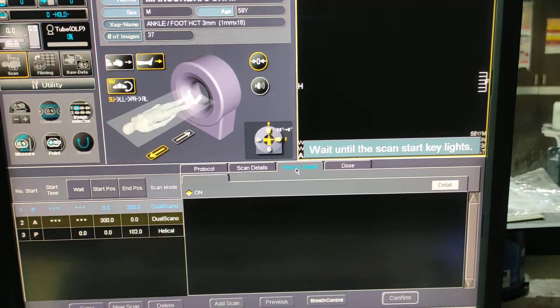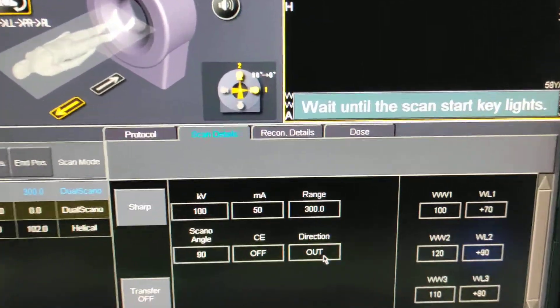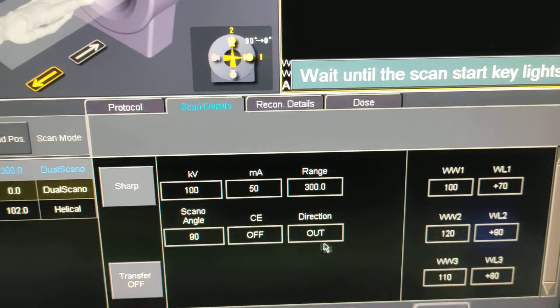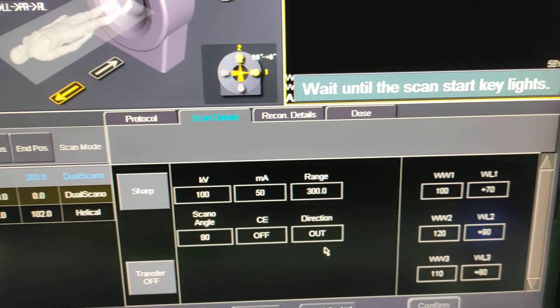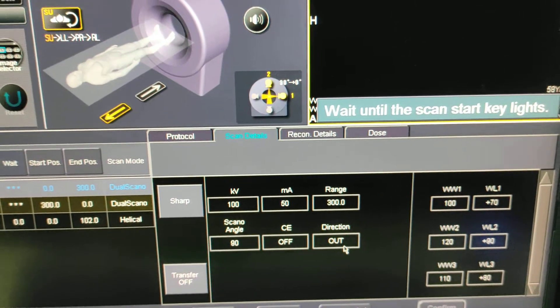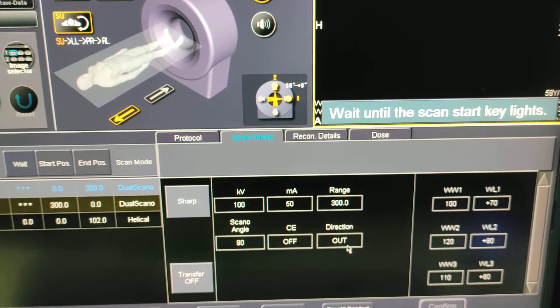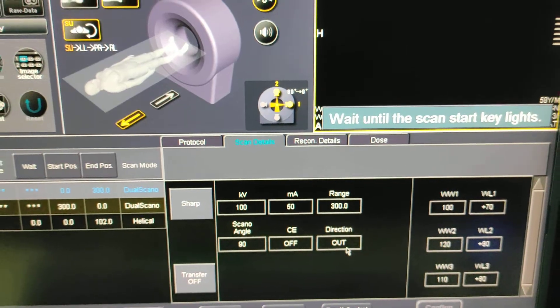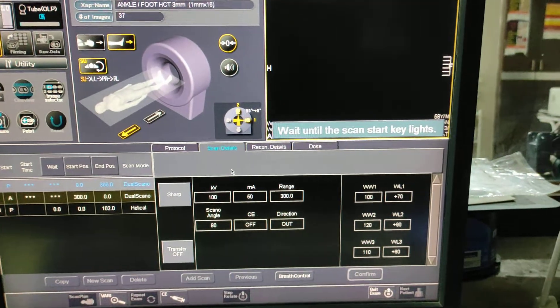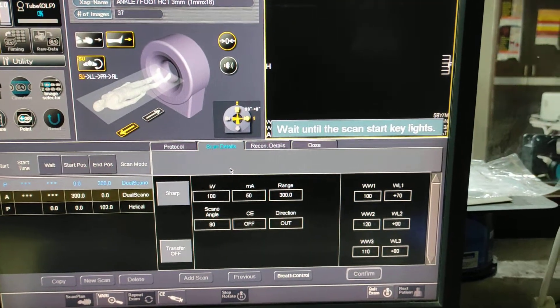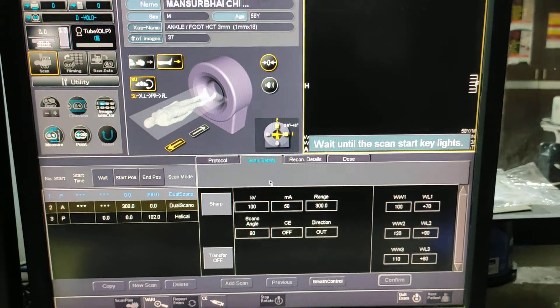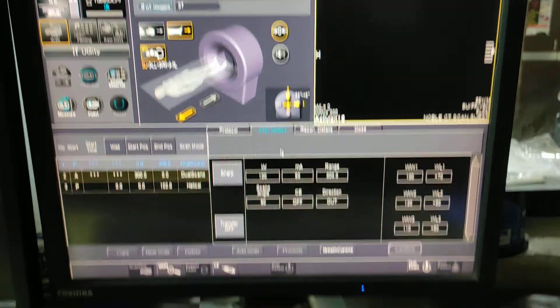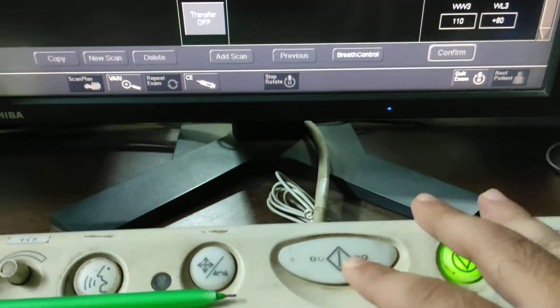Before taking the scan, you have to check your direction. The scout will be out, so I have landmark at lower end of tibia fibula. Wait until the scan start key lights. You have to press two times.